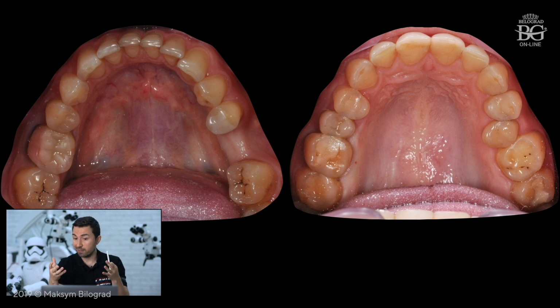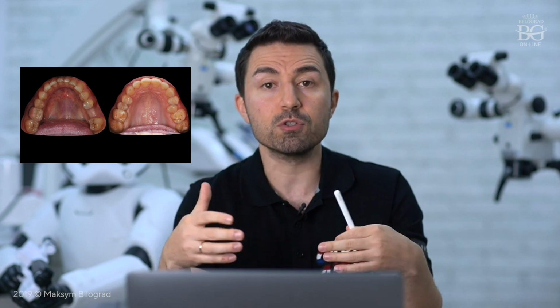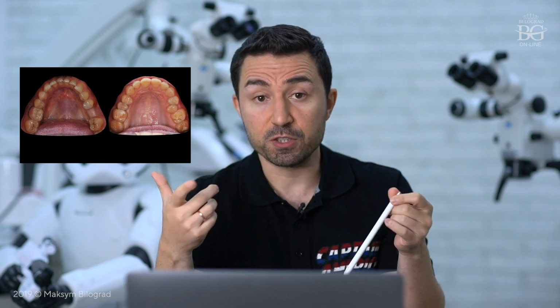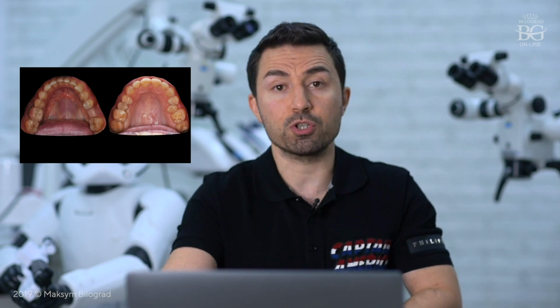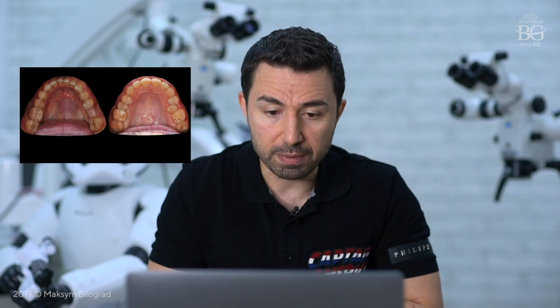Especially when you need to make teeth longer in the anterior area, you understand that you are interfering with the envelope of function. So we discussed the aesthetic outcome with the patient, and also that to get a nice, long-term aesthetic result, we have to redesign all the occlusal surfaces of the posterior teeth. Otherwise, if we just make the frontal incisors longer and more beautiful, the result will be short-term. She may break them, or she may abrade these teeth. So we decided to go for full mouth rehabilitation.